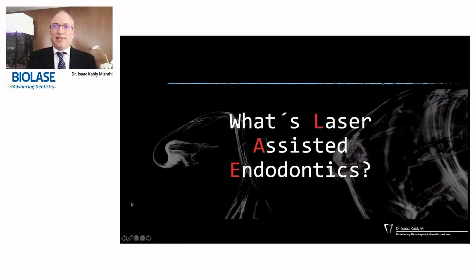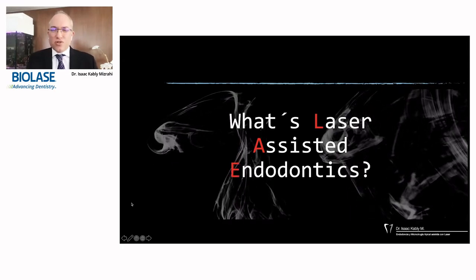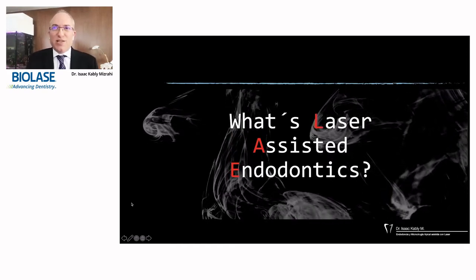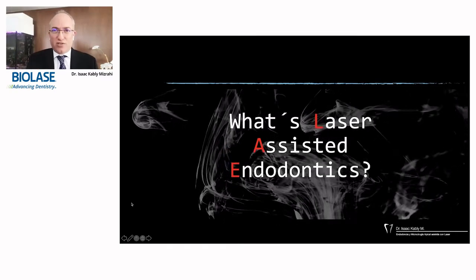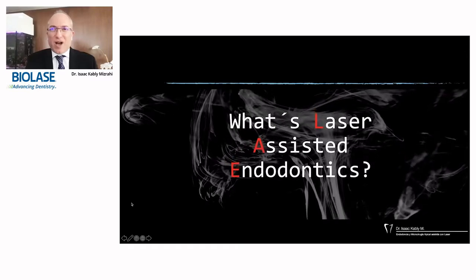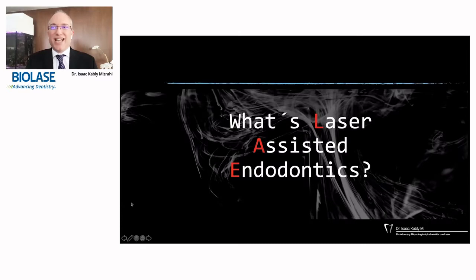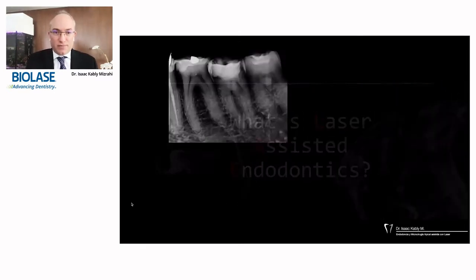So what is laser-assisted endodontics? In my concept, it's a conventional treatment, a traditional endo treatment, plus the laser energy properties that we can use in our favor as clinicians and in favor of our patients. Many in the literature and around the world are linking this term to activating irrigants inside the root canal. And this is a big part of my topic tonight.